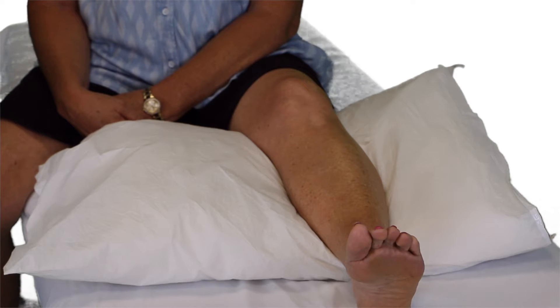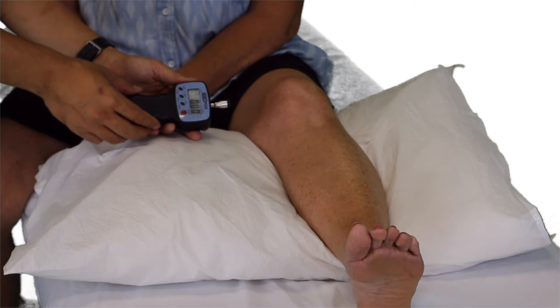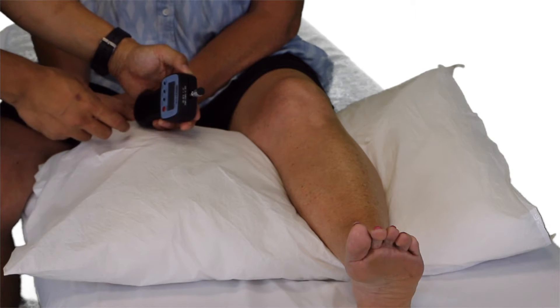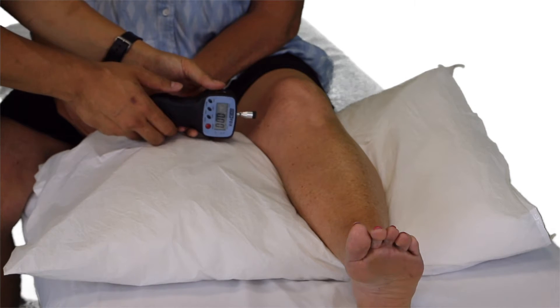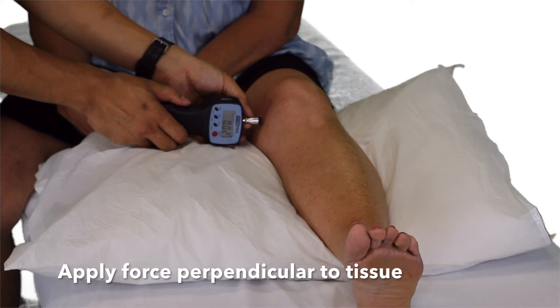To assess hyperalgesia of musculoskeletal tissue, an algometer is commonly used. It consists of a rubberized round tip that is one centimeter squared, and gradual pressure is applied to the area of most pain. Please tell me when pressure first begins to feel like pain by saying now.